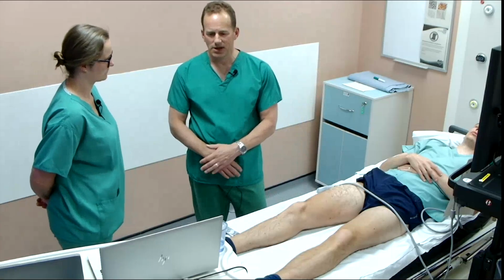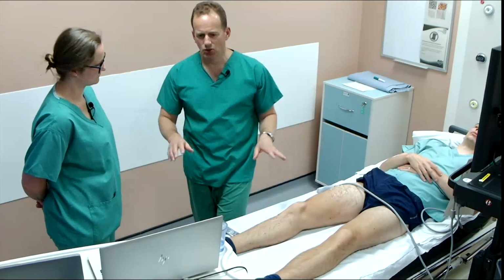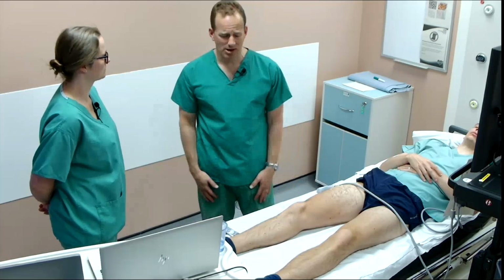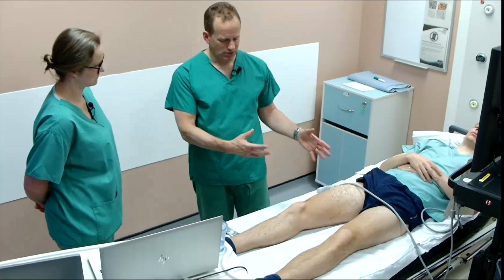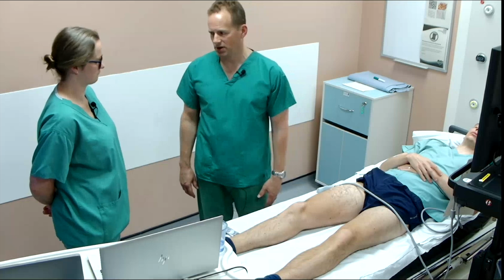And if I couldn't see them, then you could do a targeted injection along that plane. Though to be honest, if I couldn't see them at all, I just get the surgeon to put some skin local in. I mean, being pragmatic, if you can see them, it's nice to do. But if not, 20 mils along the wound will achieve the same kind of thing.